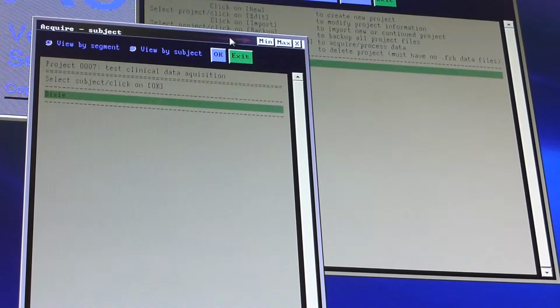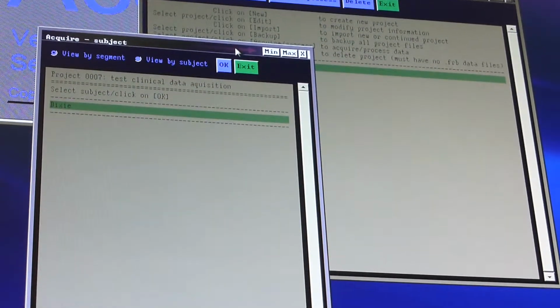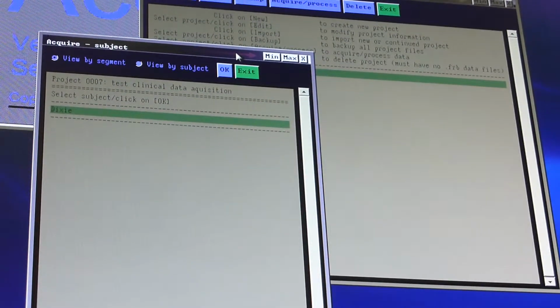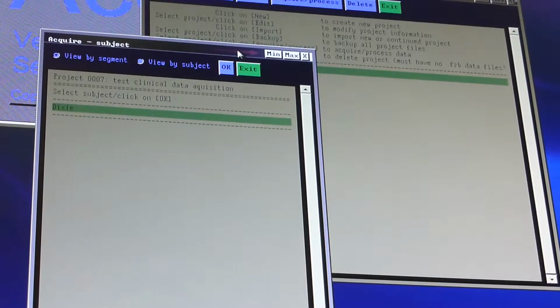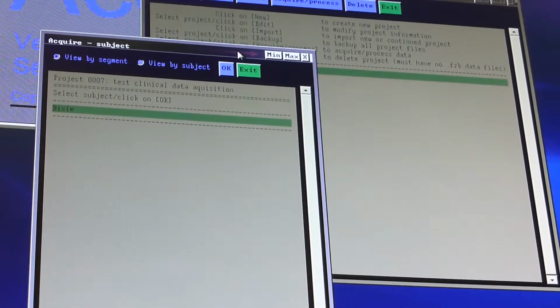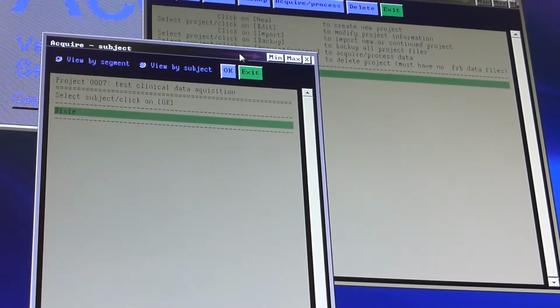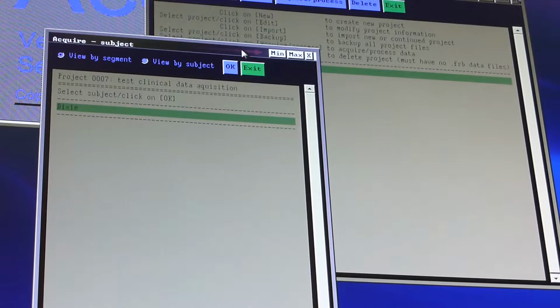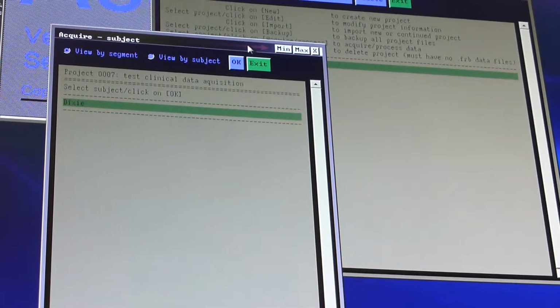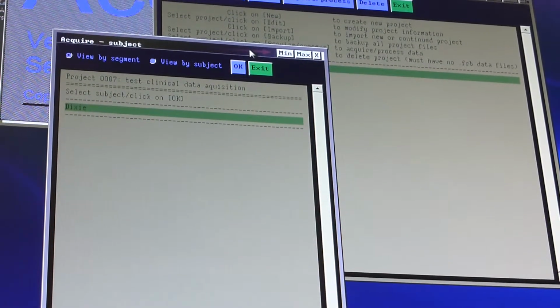Are we ready to try collecting data on a dog, or do we have some other things to go over? I've covered all the things I wanted unless you had other questions. I think that's good. Does that make sense to you guys? Start a project, enter the parameters. Yep, we're good. Yeah, I think that would be your next step.